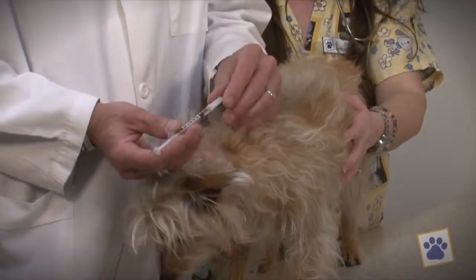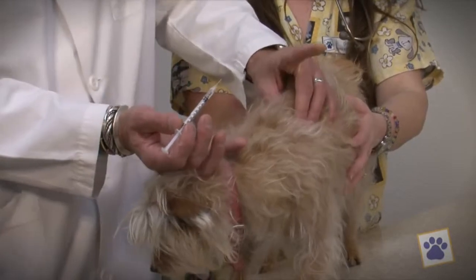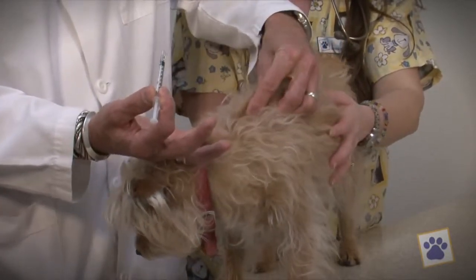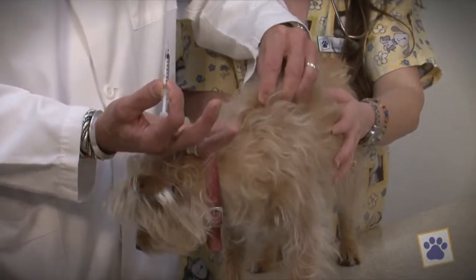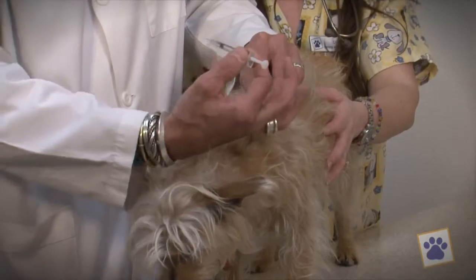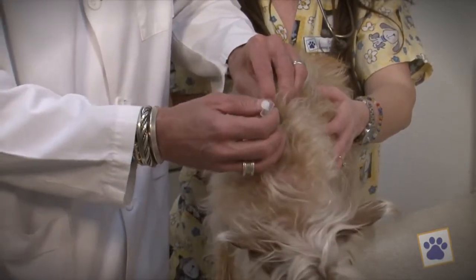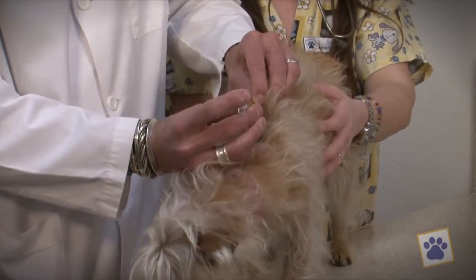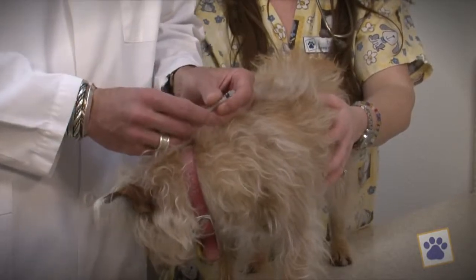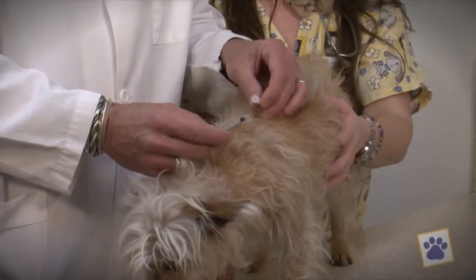This time, using the dog, remove the scabbard from the needle, make your skin tent, squeezing with your middle finger and your thumb, and then your index finger between those. I'm pulling up, and right beneath the index finger — not into either of the folds, into the skin — I'm plunging in perfectly parallel to the skin, and then I'm injecting. It's as simple as that. This is a really tiny needle, and it's very rare that any dog or cat is going to resent this.